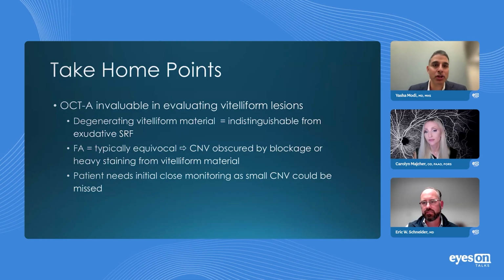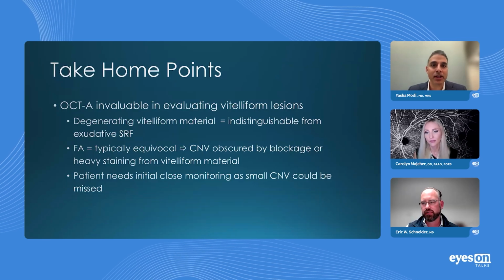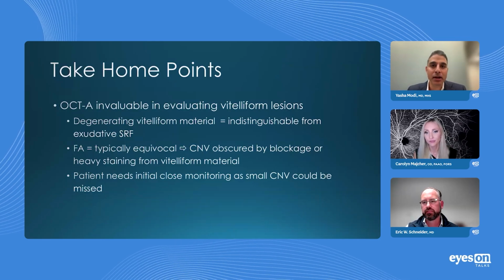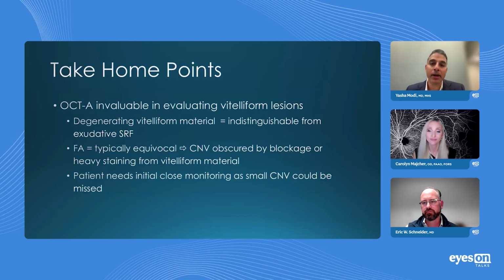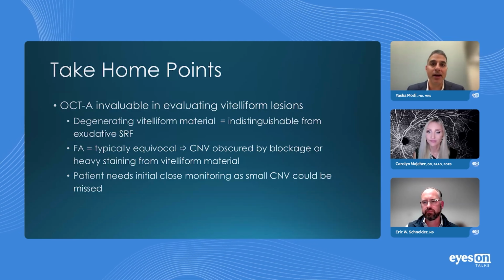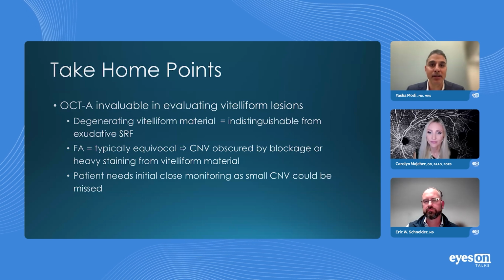So Carolyn, a quick question. In this case, you saw all these pigmentary changes, but it wasn't abundantly obvious to me that we had angioid streaks until I saw the FA. What imaging do you typically use to identify angioid streaks if you're suspecting it?